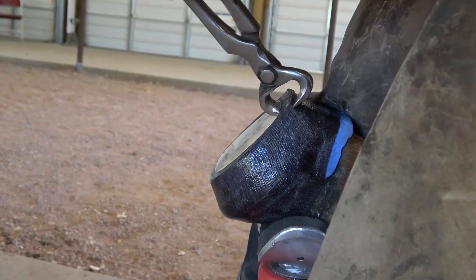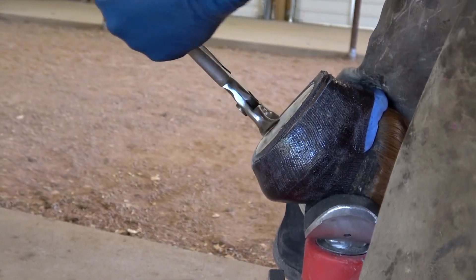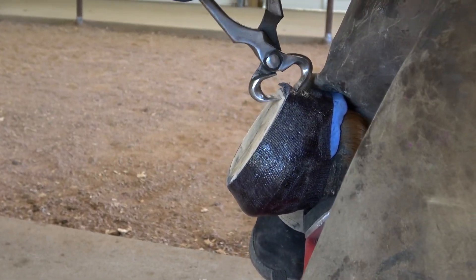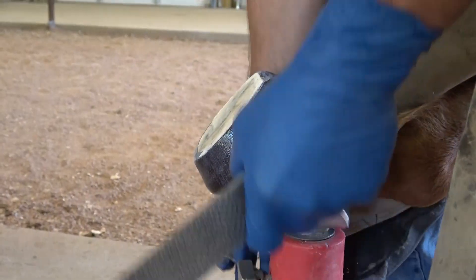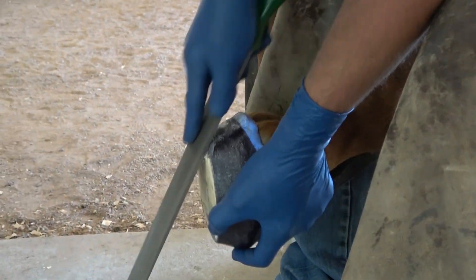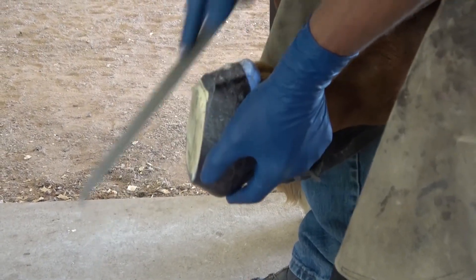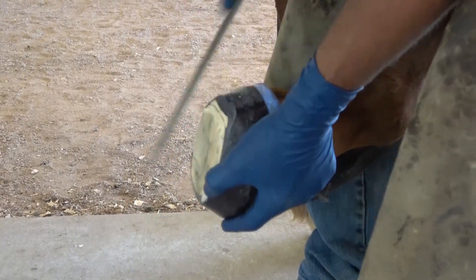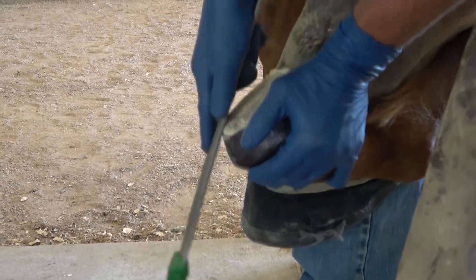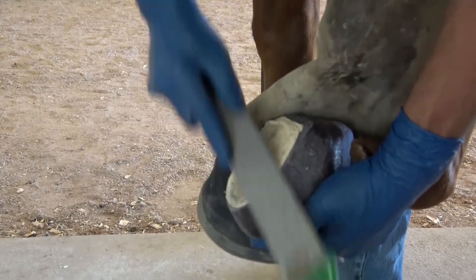I use my nippers first, just because this is fiberglass and the less filing I have to do the better. So I do a run with my nippers around, soften it a little bit with my nippers back here, and do my final dressing with my rasp. An important note: I'm pulling my rasp into the shoe and not pulling it away — that has a tendency, when the cast is still wet, to pull it off the shoe prematurely.